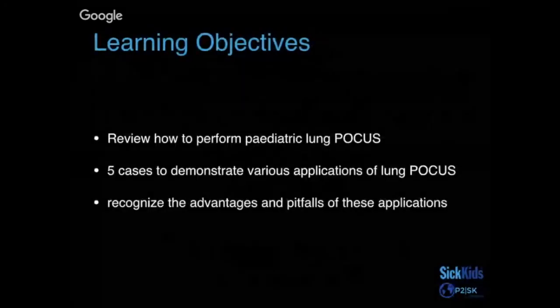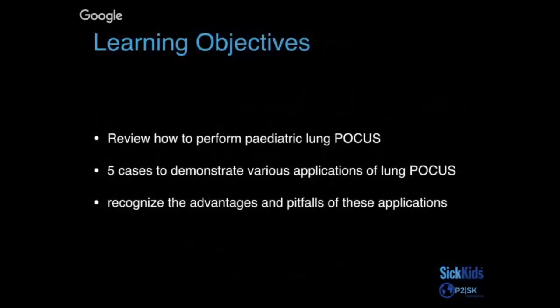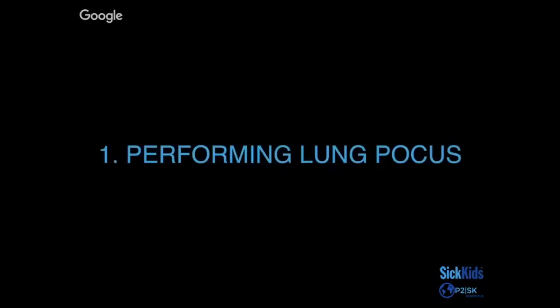So our learning objectives for today will be to review how to perform pediatric lung POCUS. We'll go over 5 cases to demonstrate various applications of lung POCUS, and we'll discuss some advantages and pitfalls of these applications. So, a general overview of how to perform lung POCUS, which some of you may already be familiar with.